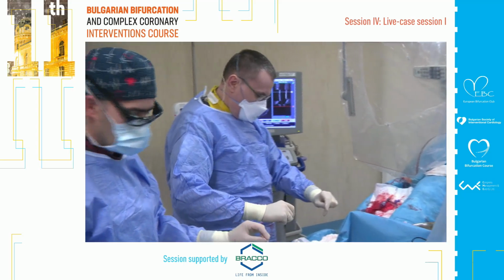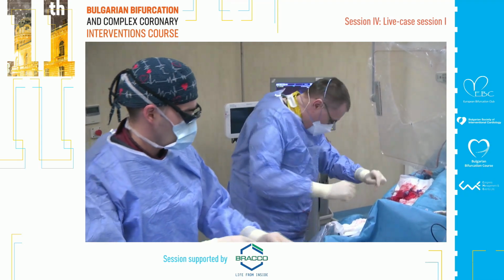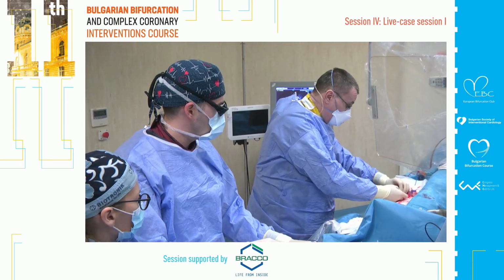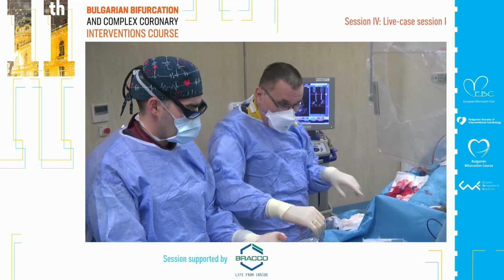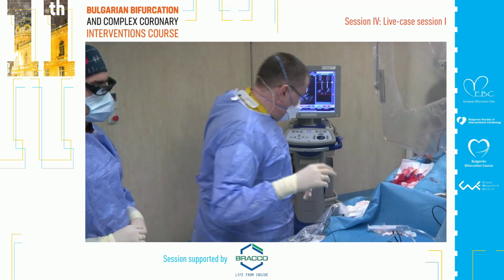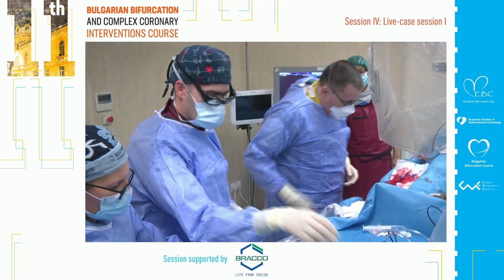I'm just asking, I'm not questioning. The plan was the initial plan. Even yesterday we bet with Valery. I said that IVUS will pass, and he said that it would not be possible, and actually he was right. I was not able to pass with the IVUS.